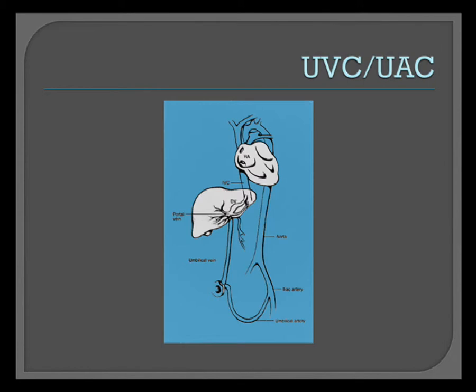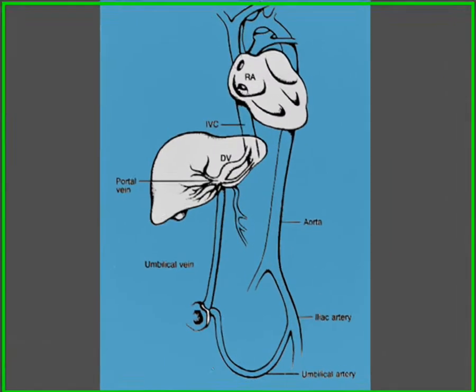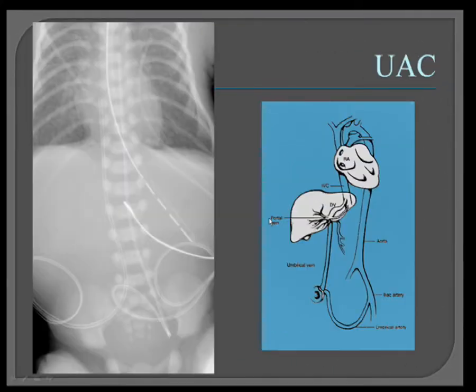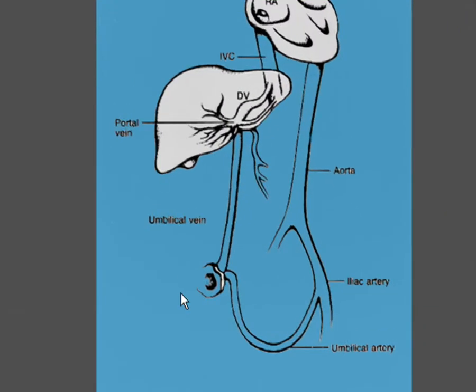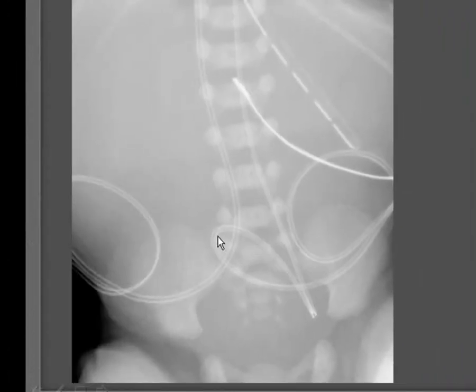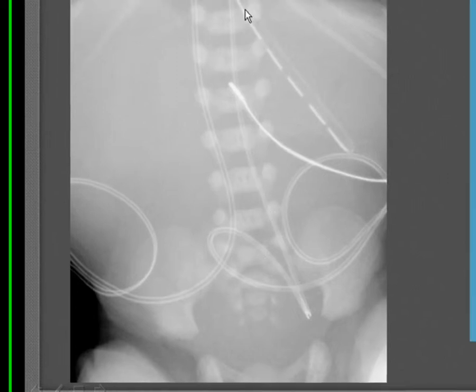First we'll discuss UVCs and UACs. This diagram shows the expected course of the UVC and the UAC. In more detail, the UAC comes down the umbilical artery, takes a characteristic turn up the iliac artery, and terminates in the aorta. In this image we can see that this is the UAC because it takes that characteristic turn and comes up here in the aorta.